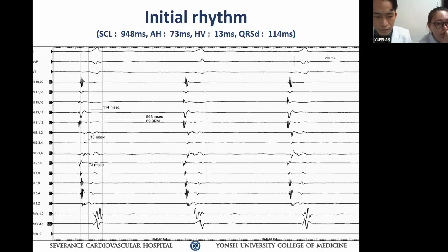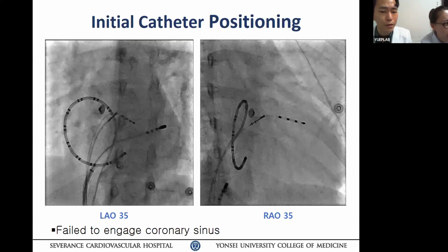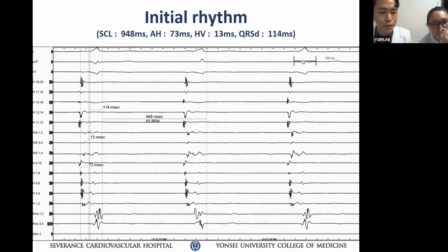What do you think, Dr. Bob? If you had the two choices, which one would you ablate? Well, that's what I'm asking you. First one, the CS distal tip was not inside the CS. Doesn't matter. If you look at the electrogram, yeah, it's in the posterior septum, right? Yeah. So before ablation, I mapped the right side septum, low crista, inside the CS. And how come you do not see this potential? I don't know. Because you moved the catheter and probably didn't look enough.